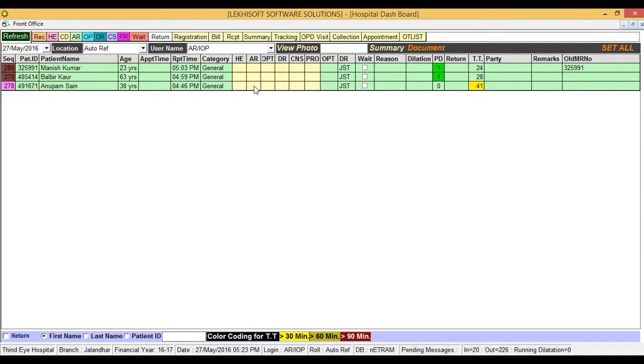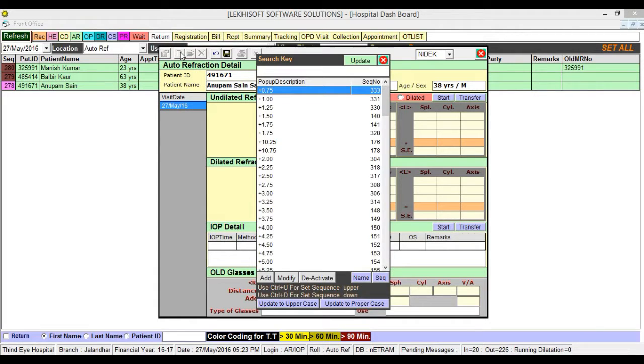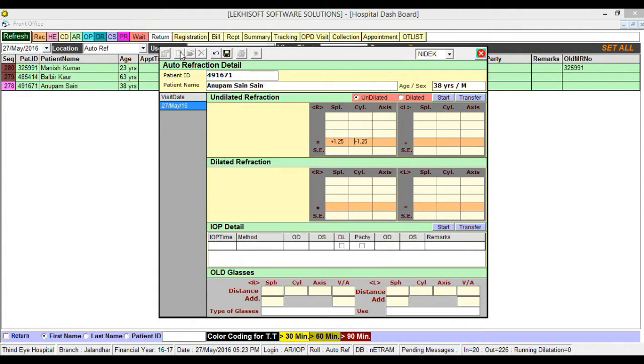Now again select the new patient and fill the details. Enter the power and then the IOP.